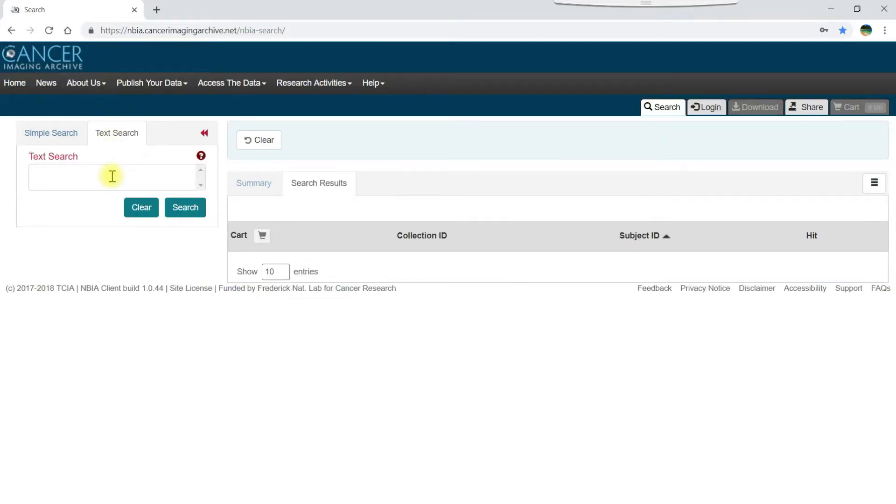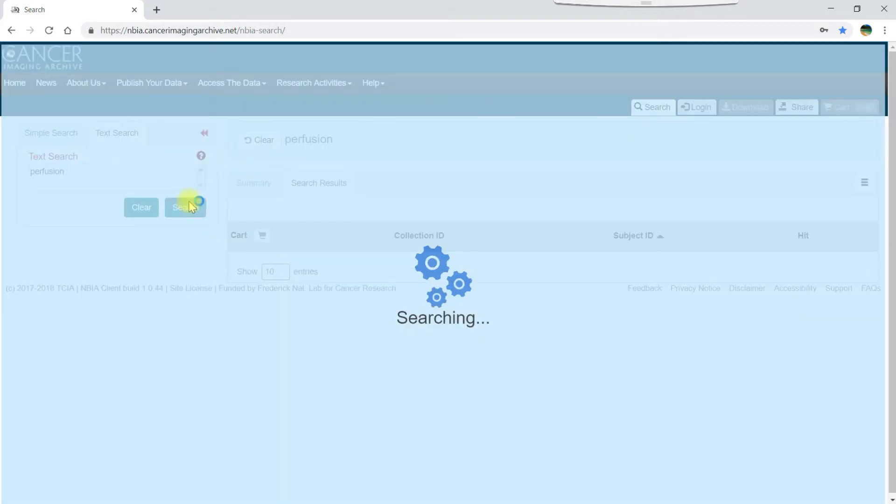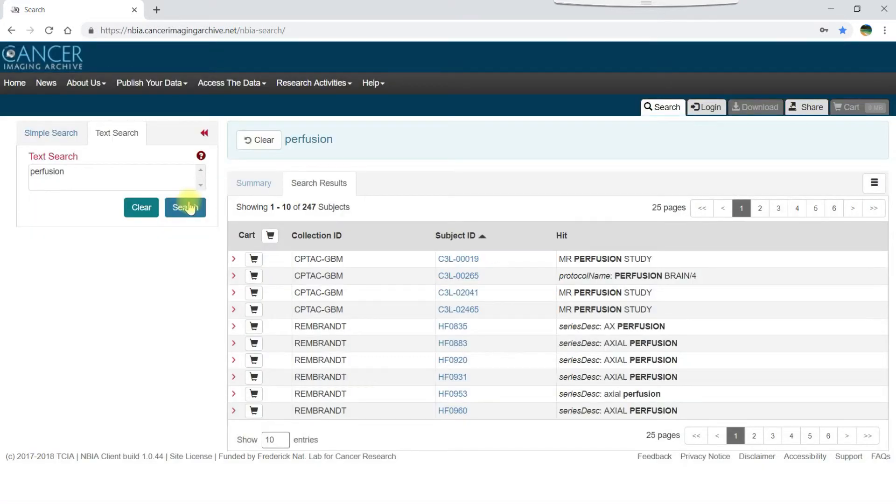For example, let's say you're studying brain cancer and are specifically interested in perfusion MR scans. Typing perfusion here and pressing enter or clicking search returns all scans that include the keyword perfusion in their DICOM metadata.